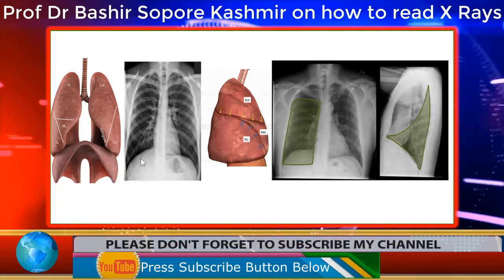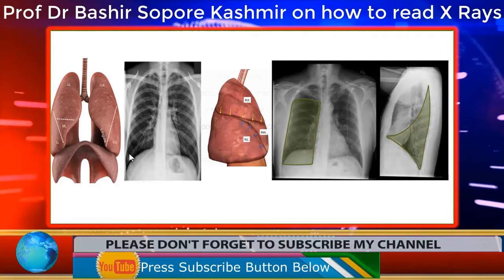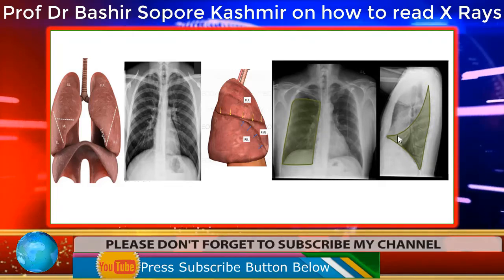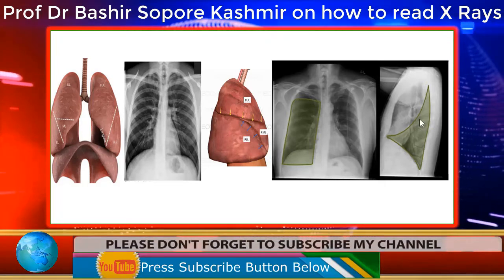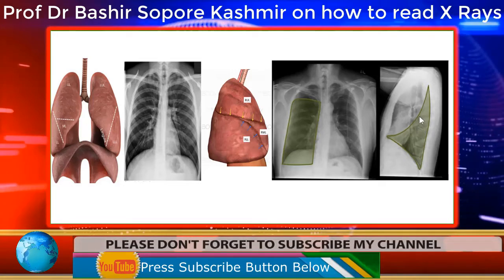So it will be merged with the opacity in the lower lobe. So the diaphragm will not be seen, right? I think this is clear. And if we have to see it on the lateral view of the radiograph, then this is behind the spine or behind the heart, right?